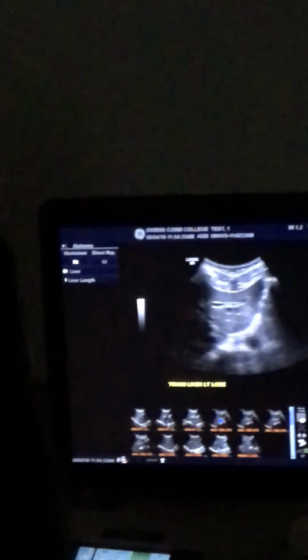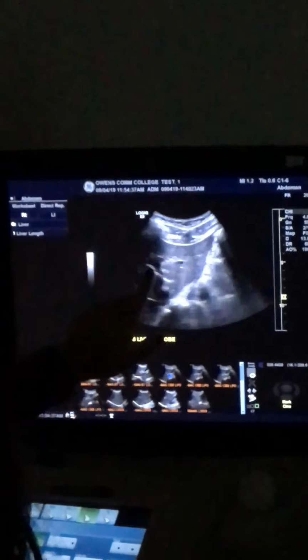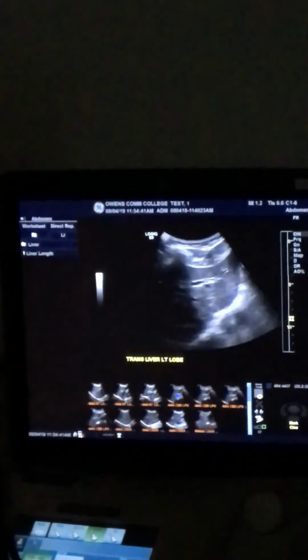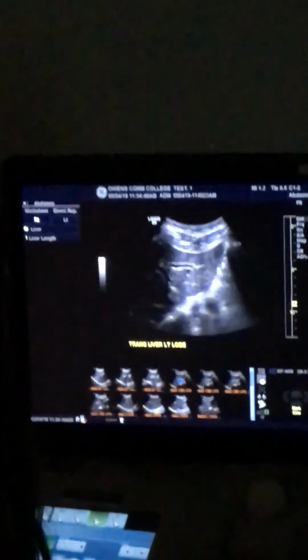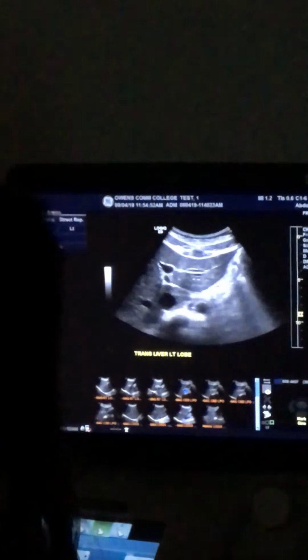A lot of students are like, I can't get it with both branches and show the liver. I don't really care. As long as you're here at the left portal vein and you're showing me left liver, don't show me this. I don't want to see this and not see the left lobe of the liver. Does that make sense to everybody? Breathe in again and hold it. I think I have it on there for you guys to label.